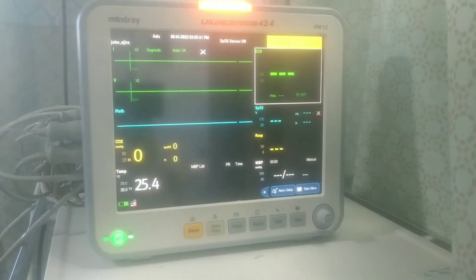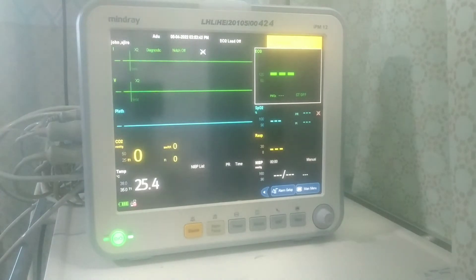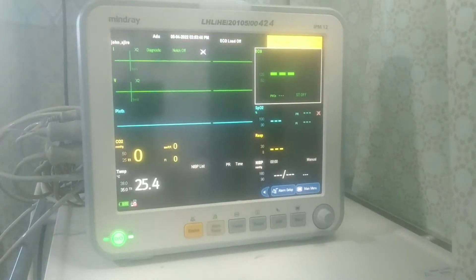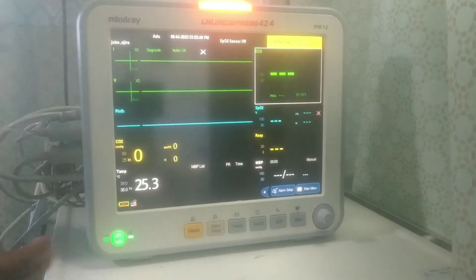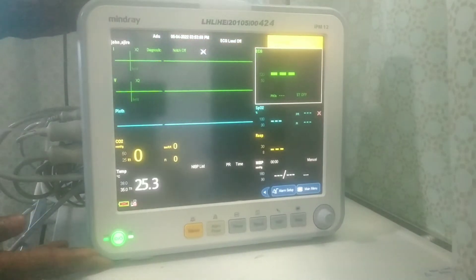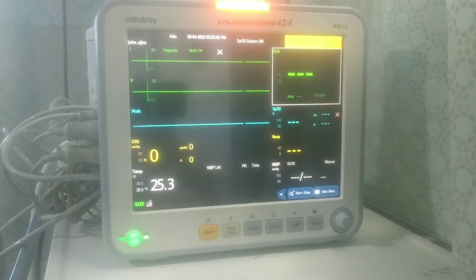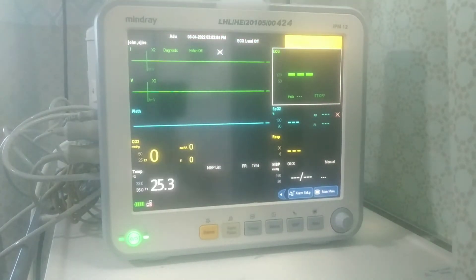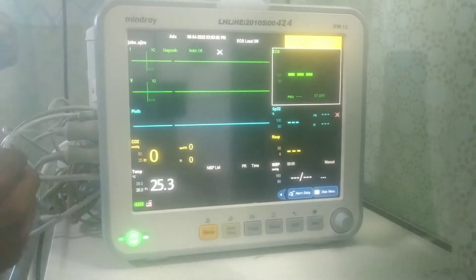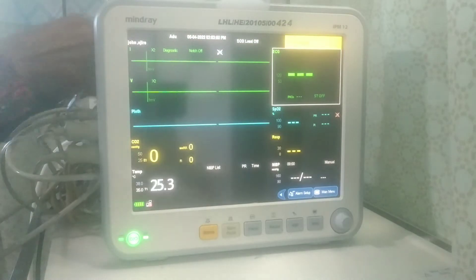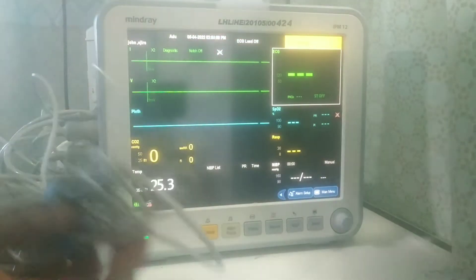I've now taken you through all the probes, the connectors, and the connection ports. I want to take you through the various ways to monitor the patient. First I will start with temperature monitoring.